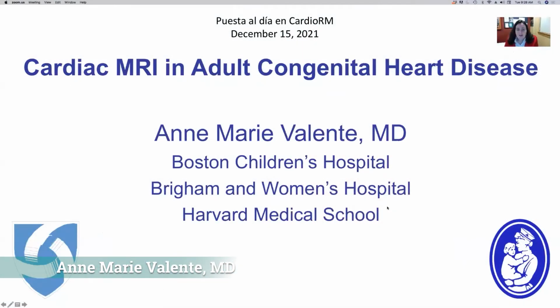Thank you for inviting me to be part of your program. Today, we are going to be discussing cardiac MRI in adult congenital heart disease.